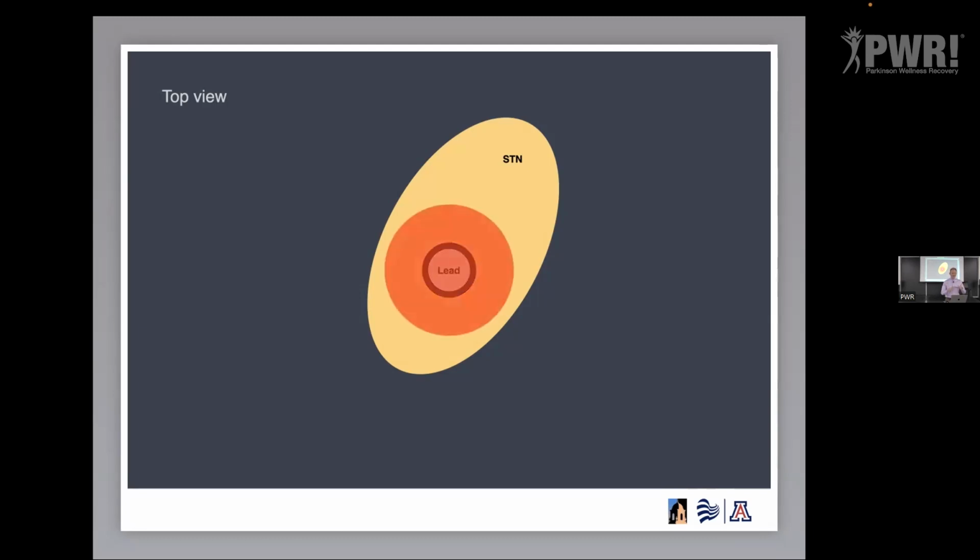When we turn it on, it's going to stimulate concentrically, right? So it's going to stimulate in all directions. If the electrode is smack dab in the middle where it's supposed to be, this is fine. Now to put a little scale on this, that STN that we're showing, it's only about 4 millimeters wide, and the electrode is just over a millimeter wide. So your accuracy has got to be ideally a millimeter or less.